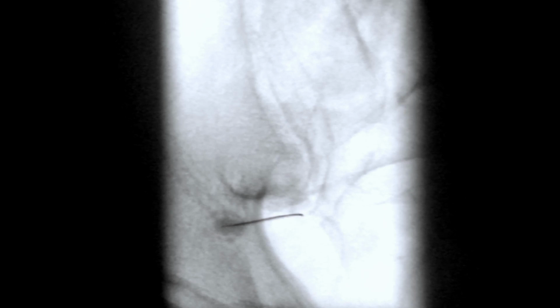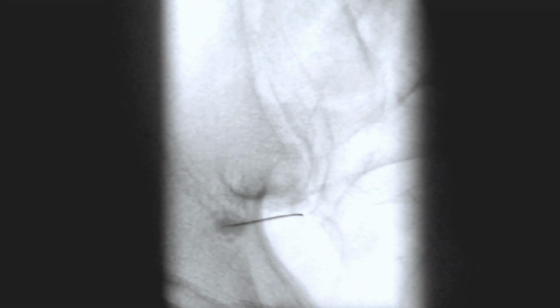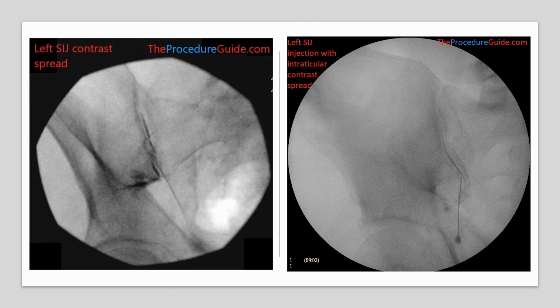Although the sacroiliac joint, SIJ, is large, its complex nature and individual anatomical variations can make it difficult to access. However, in my clinical practice, I've noticed that the inferior recess approach has the highest success rate when compared to targeting the lower one-third or other approaches in sacroiliac intra-articular injection techniques.